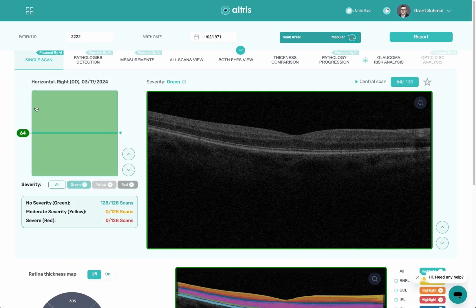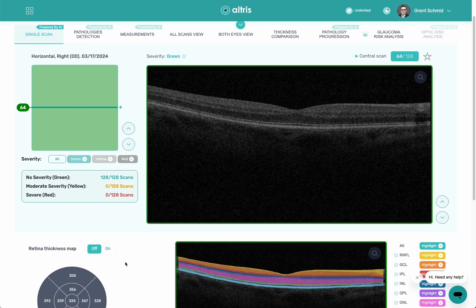The first thing you'll see here is our traffic light system — green, yellow, red. It's going to show you of the scans how many are green, how many are moderate, and how many are severe. This is an example of a patient that doesn't have anything, so it's easy to quickly see there's nothing going on with this patient and I can move on.